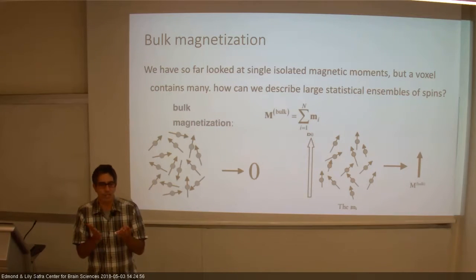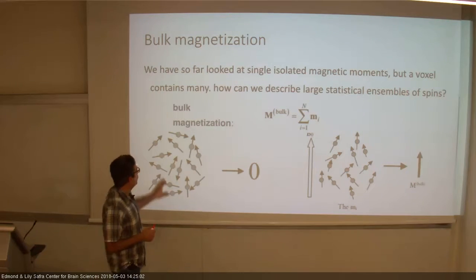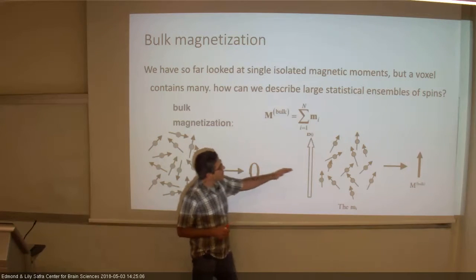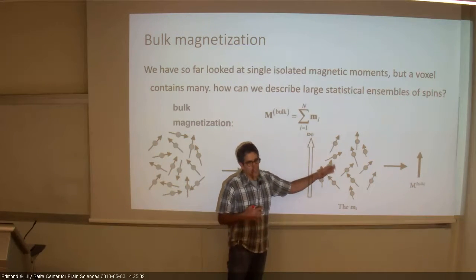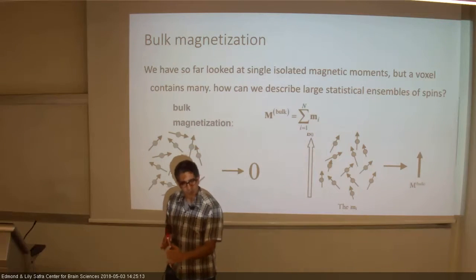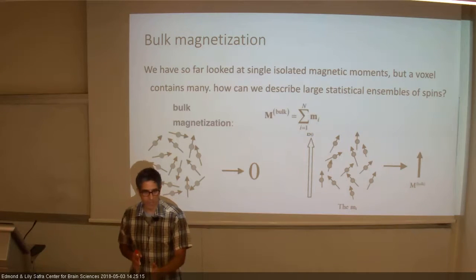There is no preference orientation because the magnetic field is too small, and it just doesn't have any effect. But when we put all those spins inside a very strong magnetic field, then some of them will start to align along the magnetic field. Like if you put a needle near a magnet, it wants to orient itself to the magnetic field.